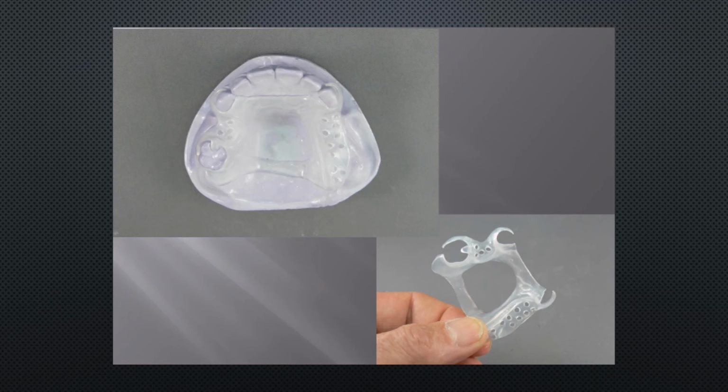So there's a little bit of education that needs to happen with your accounts. You've got to say, look, I'm going to give you this clear frame. It's not going to be optically crystal clear. And here's why being optically crystal clear isn't exactly an ideal situation and why this material would be better. Once they get that first case and understand, they aren't surprised by it, they love it.